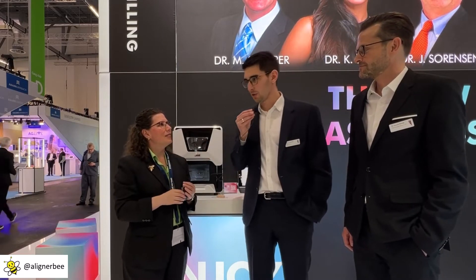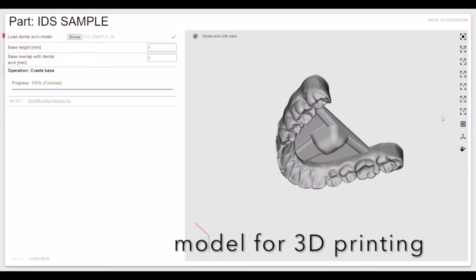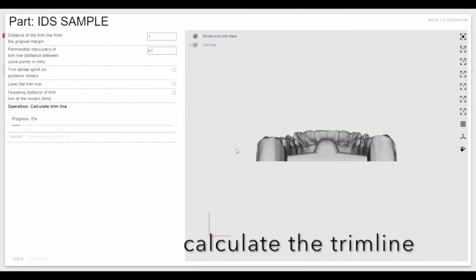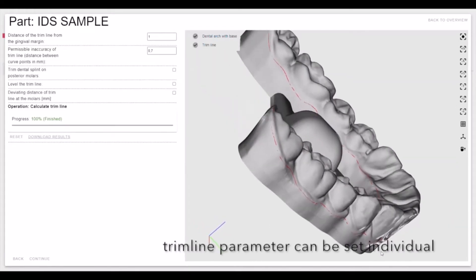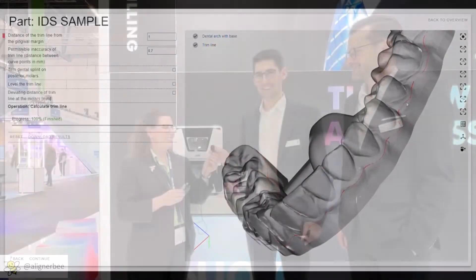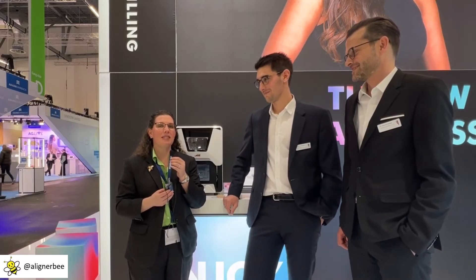We have a high level of automatization for designing the trim line. You can set the options and set the trim line how you want, and the software automatically detects the margin line. That's it — easy. Automation definitely saves us time in the dental laboratory.